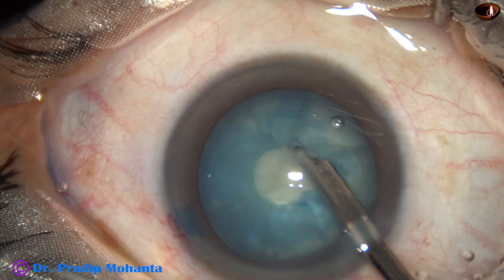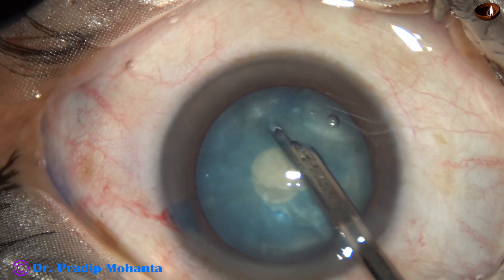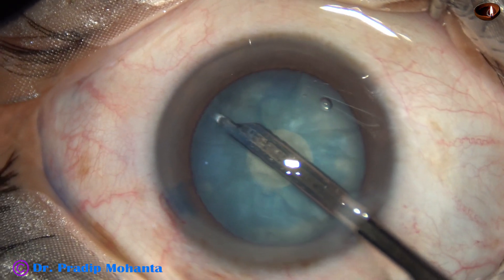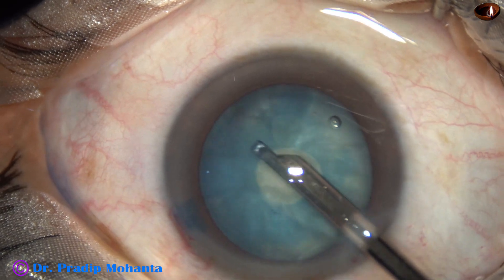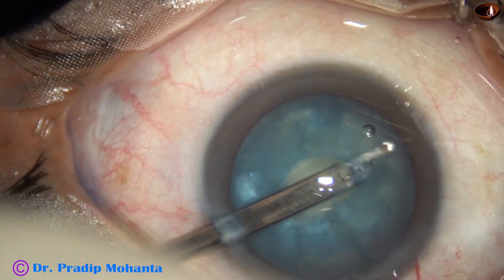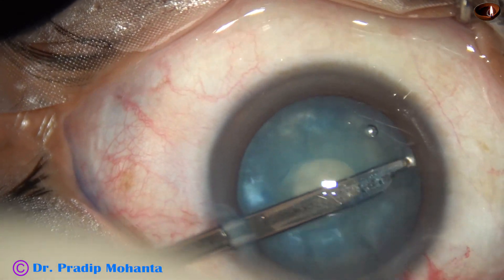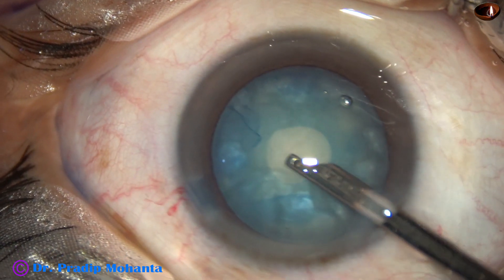Now some amount of cortex is removed. Some superficial lens matter is removed and the intralenticular pressure is reduced in this way. I have made the side port at about 1.8mm so that this 23-gauge Simcoe can easily go through it. The side port is three clock hours away from the main incision so that the astigmatism induced by the main incision is neutralized to some extent.